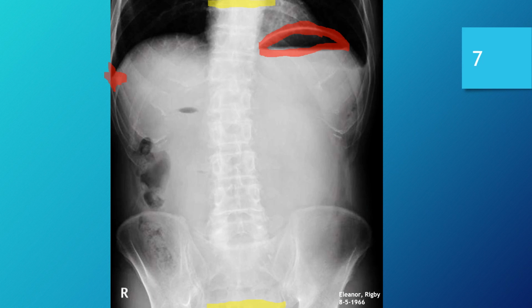So good choice there for this exam. So yes, we have the pertinent anatomy we need, except for that small portion of the diaphragm over there.